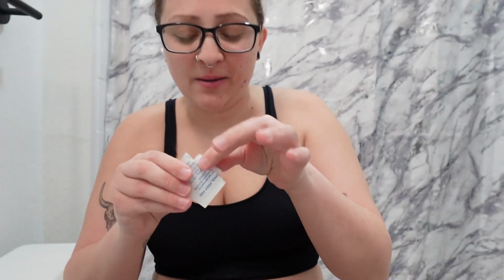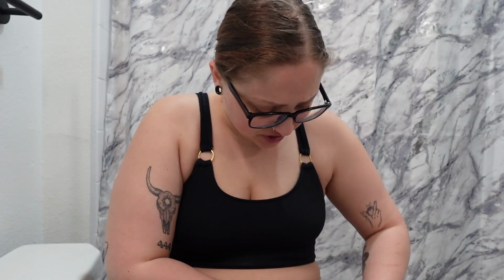We're gonna rip her off. She was so close to coming off anyway. So what do I know? I'm gonna go ahead and just clean that spot up because a little bit of insulin came out. And I just wanna make sure that I clean the spot up that I literally just tore open. Let's go ahead and take care of changing the pump site.